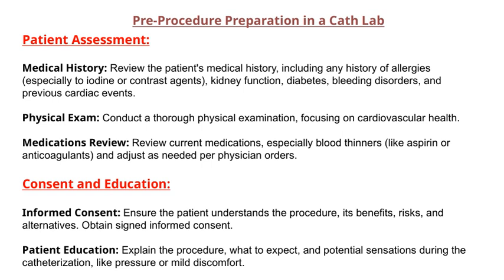Moving on to consent and education, first, we make sure the patient understands what the procedure entails, the benefits, potential risks, and available alternatives. It's important they give informed consent by signing the necessary documents. Finally, patient education plays a key role. We explain what they can expect during the procedure, including sensations like pressure or mild discomfort, which are common. Clear communication helps reduce anxiety and prepares them mentally for what's to come.